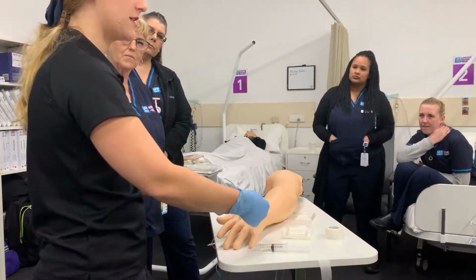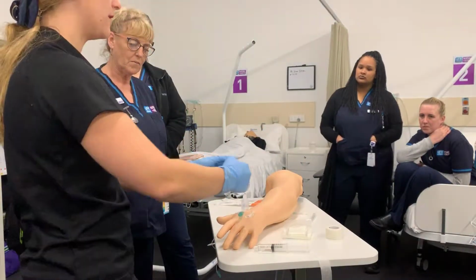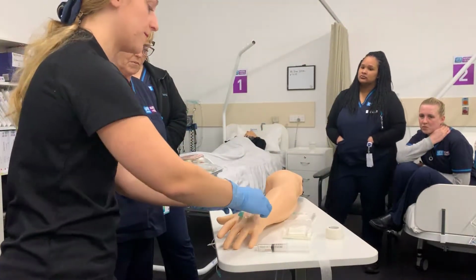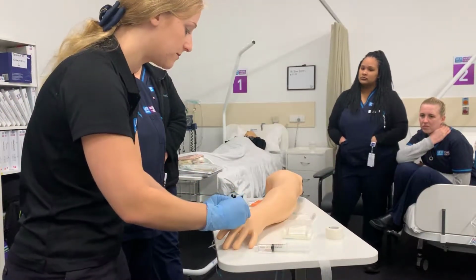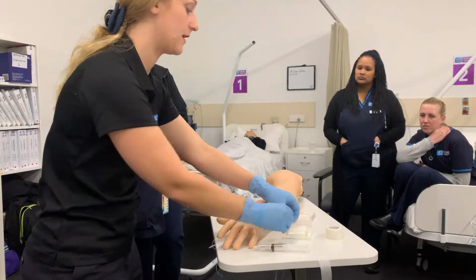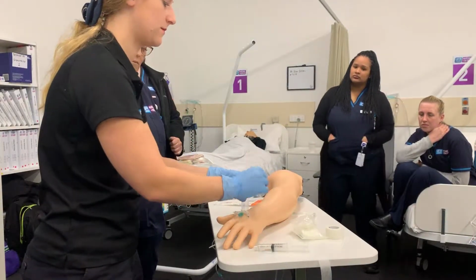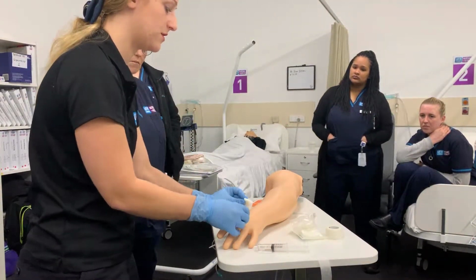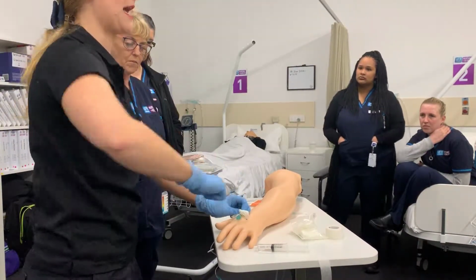Before when we changed the tegaderm, we made sure we peeled that way. Now we're going to peel this way because we're going to gather it all together. So I pull the tape back till the site's exposed. It wouldn't be bleeding at this point though because the cannula is still in, okay? I'm going to take my gauze. Usually I fold it into a little square.